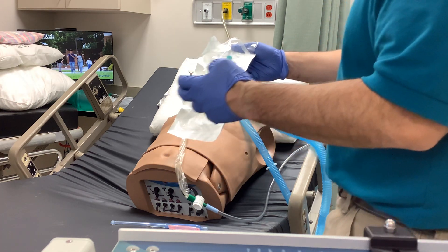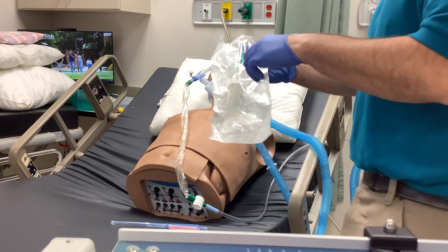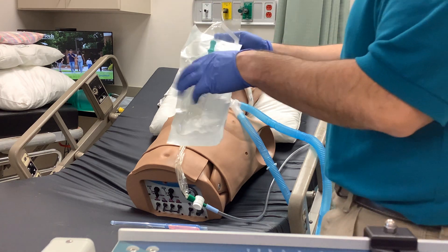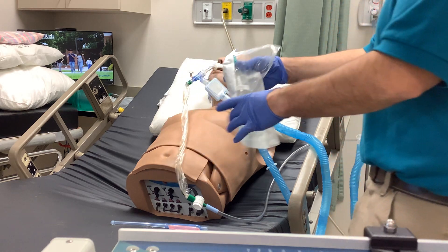These come in various different configurations. Some of these have a particular lid on them and you send it off with that lid. Others have a solid cap that you would put on after you collect your sample. It just depends upon what your hospital orders and where you're at.